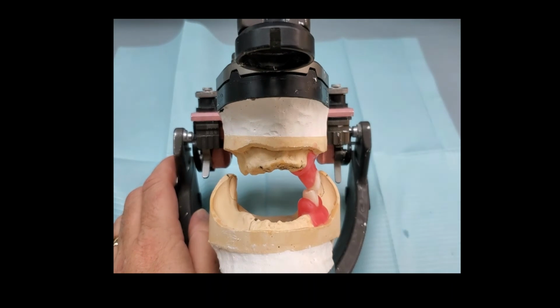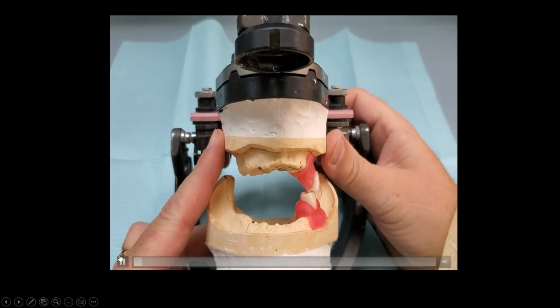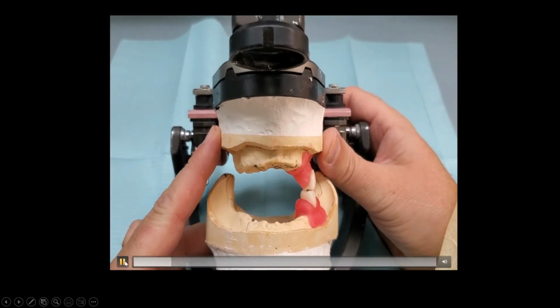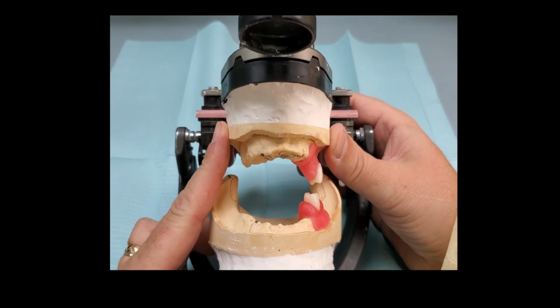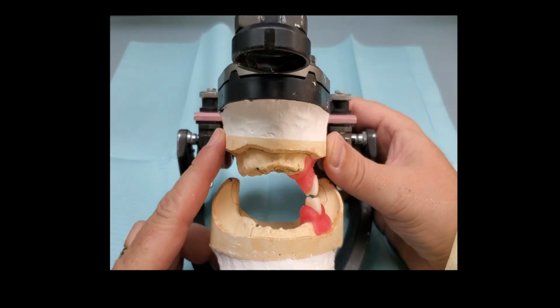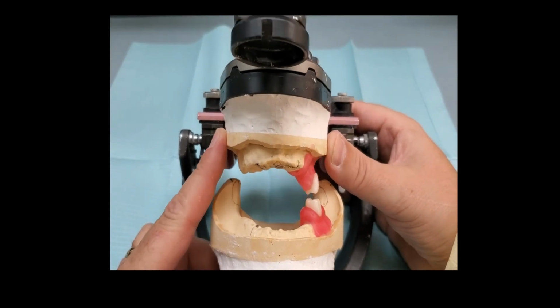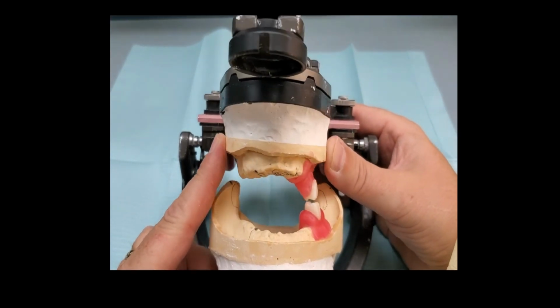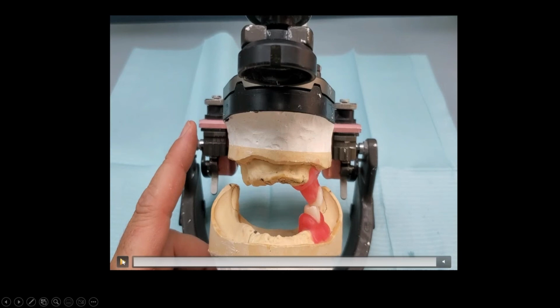Well, now with the videos that you've seen of select patients and the understanding of a chew cycle, it doesn't work like that. This is what I want you to start doing. Move an articulator like this. Start to move it like a chew cycle. You want to see all of those cusps function within what you perceive to be the chew cycle of a patient. And if you don't know the chew cycle because you're a technician and you never see the patient and the doctor will never tell you this information, well, then you make an educated decision. And you make an educated guess as to the information you have available, if you have any information available of the patient. But you know that there's a chew cycle. So then work the articulator like there's a chew cycle.